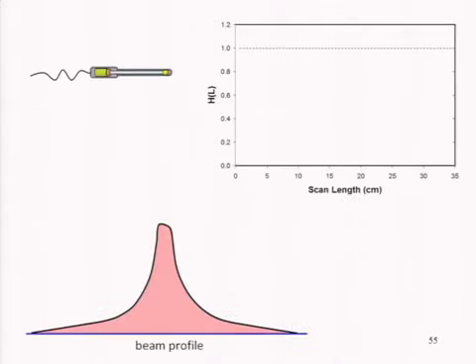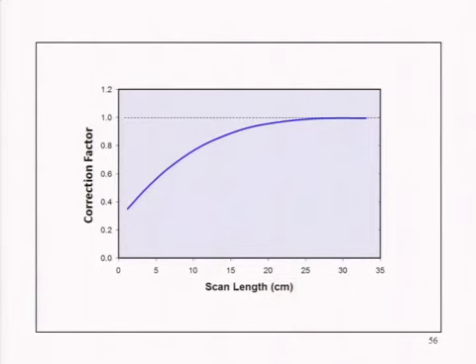It turns out that all you have to do is integrate this, and you get the rise to equilibrium curve. So one measurement with a real-time probe gives you the data that you need to get this curve. Why do you need this? Why is this useful clinically? Why does it lead to more accurate dose estimation? That is shown in this slide. So you have this correction factor.